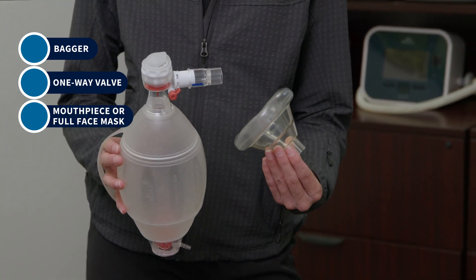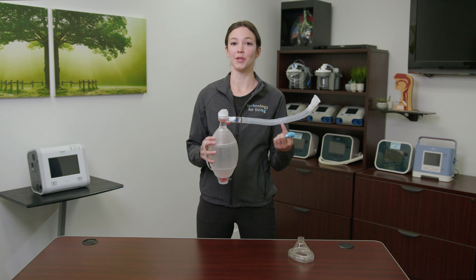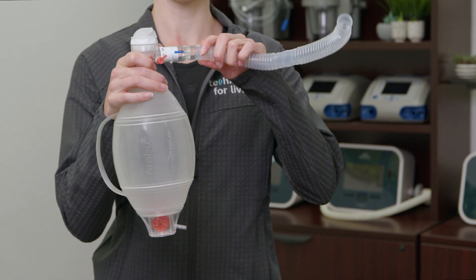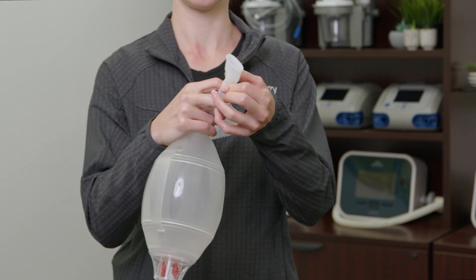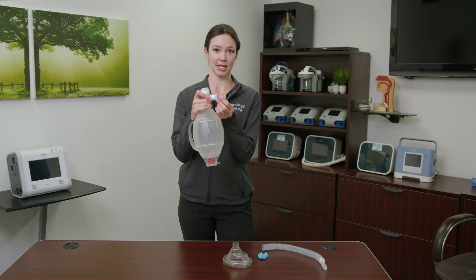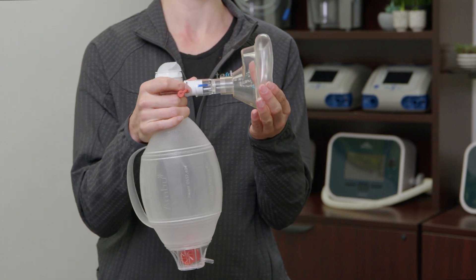The self-inflating bag allows you to provide breaths by squeezing and releasing. The valve system helps control the flow of air. To assemble: first attach the one-way valve to the bag, next attach the flex tubing, followed by the mouthpiece. For mask use, first attach the one-way valve followed by the mask.